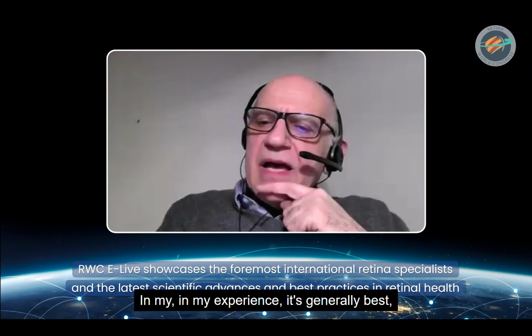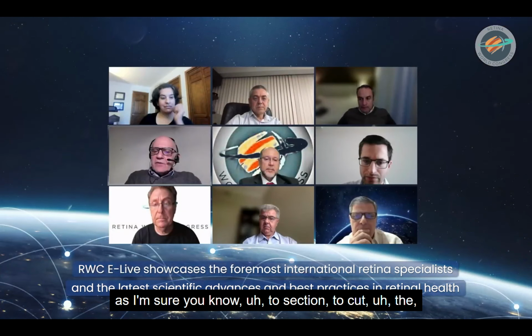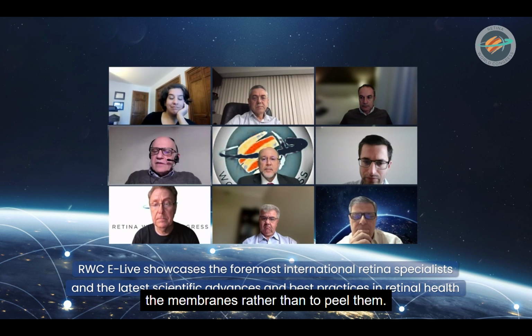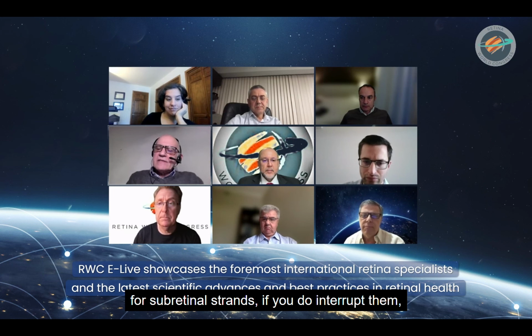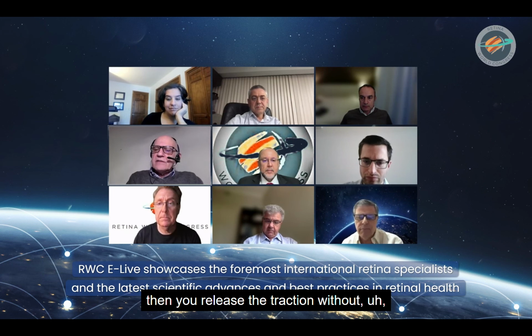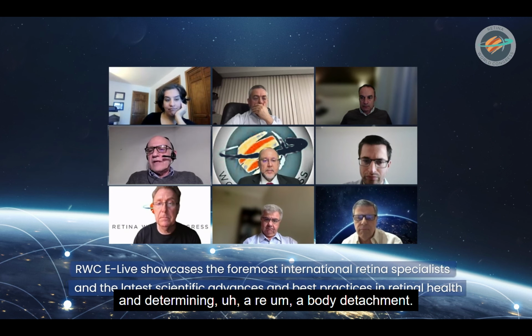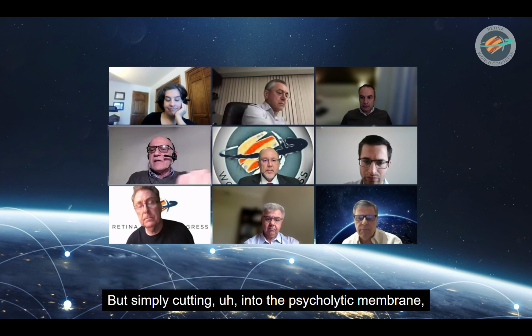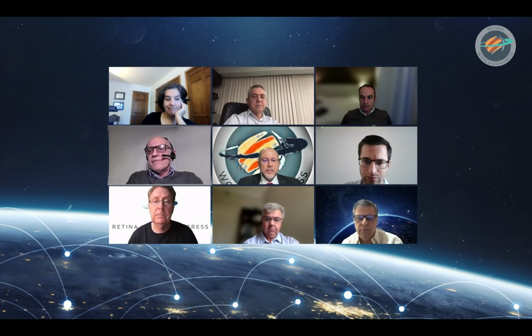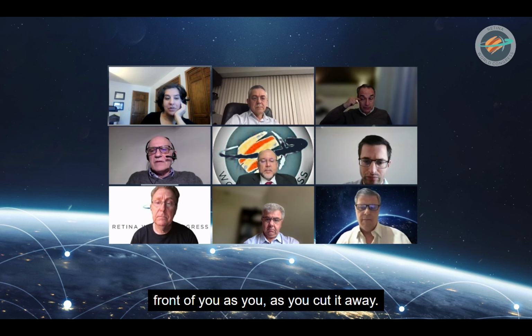Gita, in my experience, it's generally best, as I'm sure you know, to section, to cut the membranes rather than to peel them. So if you interrupt them, similarly to what you do for subretinal strands, then you release the traction without pulling on the ciliary body and determining a ciliary body detachment. So simply cutting into the cyclitic membrane is generally enough. I agree. Often you can see the traction release right in front of you as you cut it away.